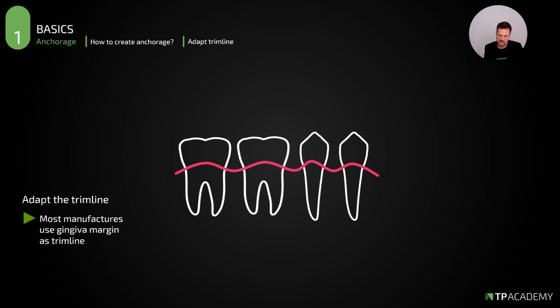So for some cases, if we have very retroclined upper anteriors, and we have the 3 different steps of movements like proclination, intrusion, and retraction, what we can see sometimes is that, especially when it comes to the third part of the retroclined pattern, which is the bodily retraction of the anteriors, it could help if the aligner goes a little bit over the gingiva. And this is something that some of the doctors, they like to program it, and they have very nice results.